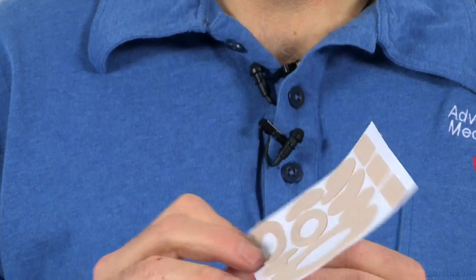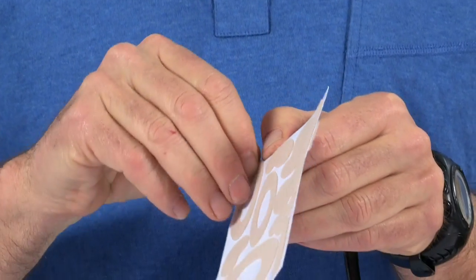Pre-cut and shaped moleskin blister dressings make easy work of treating blisters and hot spots. No scissors required.